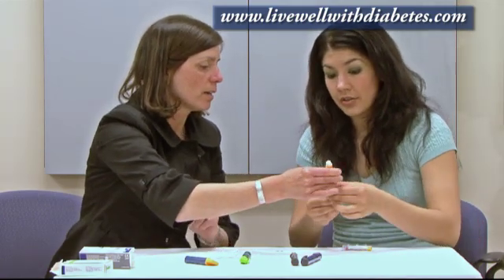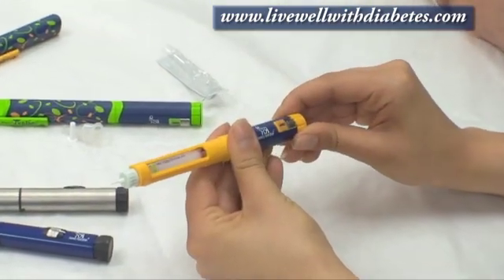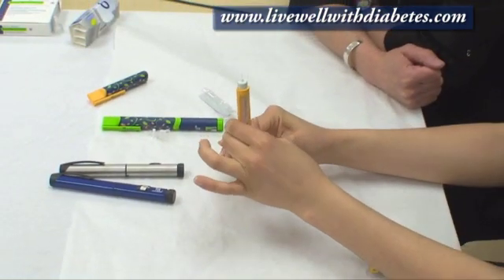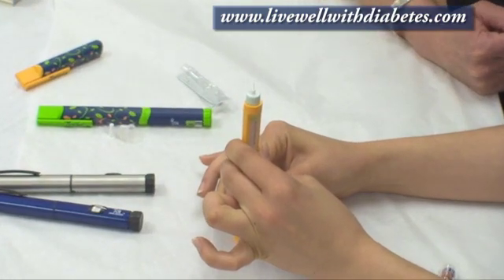Would you like to try that? Sure. If I dialed too much, I'm going to pull it up. I can see the silver area — press down on the table. Perfect — back to zero.